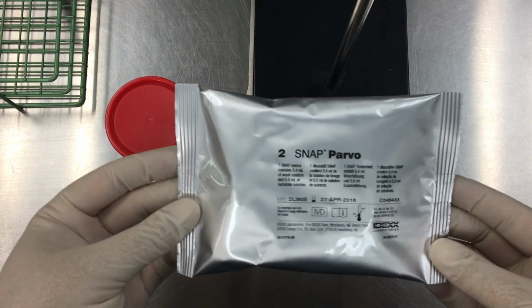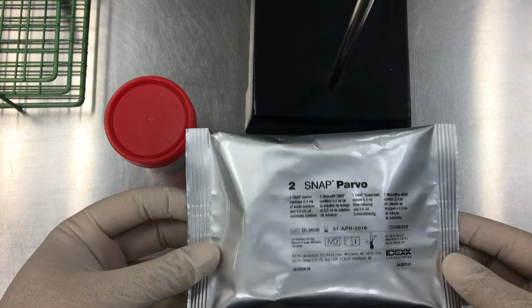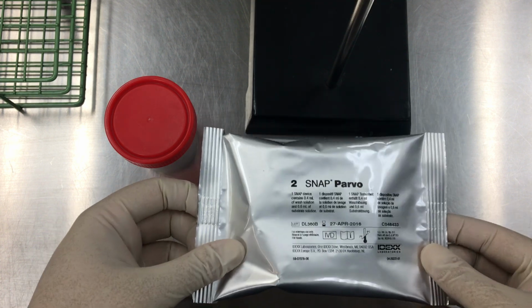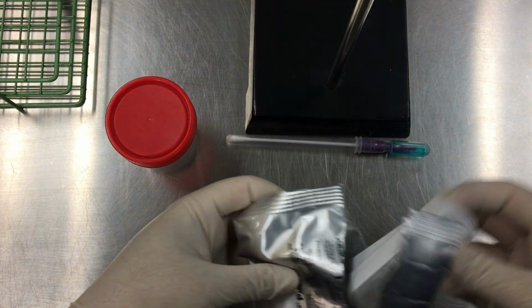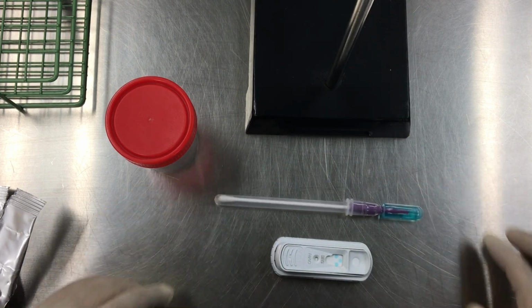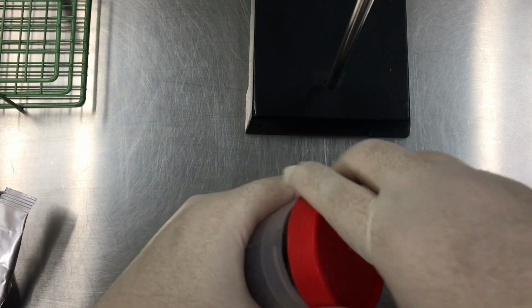Okay, so in this video I'm going to show you how to run a Parvo test, and know that if you're running a SNAP Giardia test, the directions are basically the same. This test requires a fecal sample. So you need to make sure that your test and your conjugate are at room temperature before you begin, and then get your fecal sample.